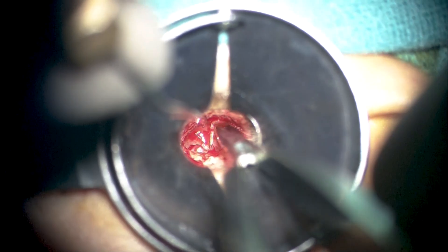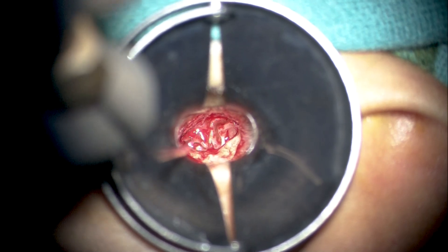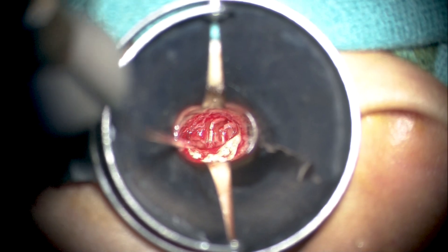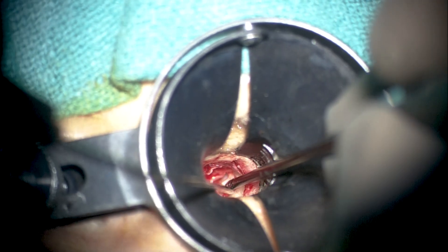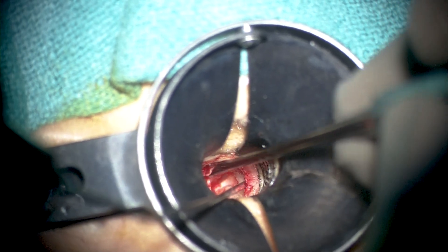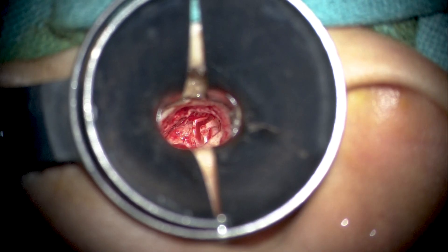We have gone all the way anteriorly to the level of the malleus neck to clear this epithelium from the surface of the chorda. All middle ear structures are now very well preserved, including the chorda. The key point is to irrigate and not let the nerve desiccate due to constant elevation of structures from it. The middle ear is clean with no granulations, disease, or discharge. The epithelium and retraction pocket have been broadly elevated from both the incus and the chorda tympani. The incudostapedial joint is intact and able to perform conduction.